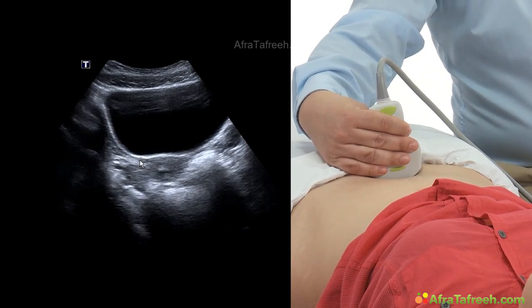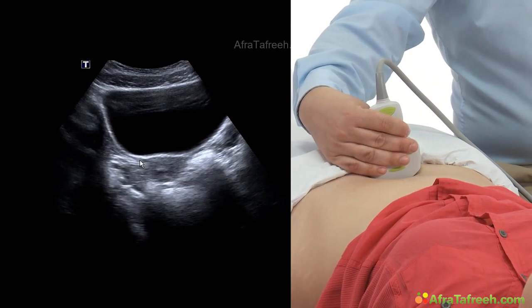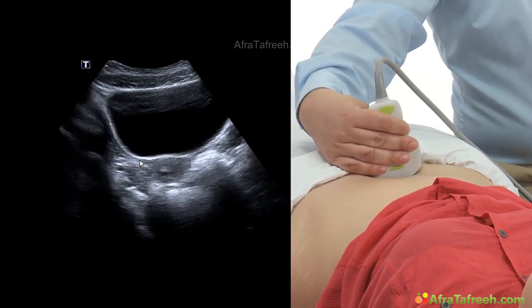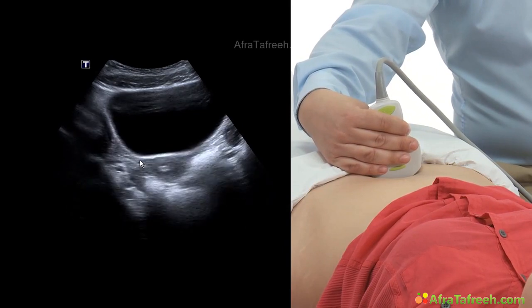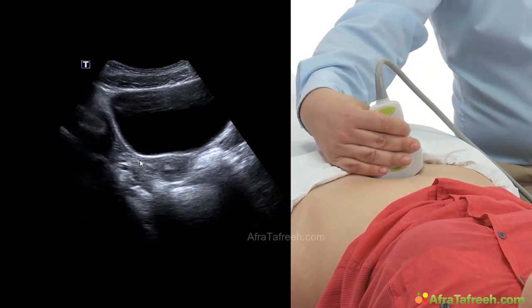Depending on the filling of the bladder, the uterus is elevated and pulled into a dorsal position when the bladder is full. And when the bladder is empty, the uterus tilts down and lays on the empty bladder. So in this case, we have the position of the uterus quite cranial and dorsal.